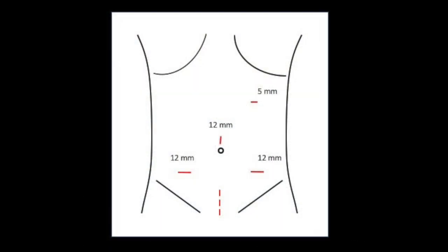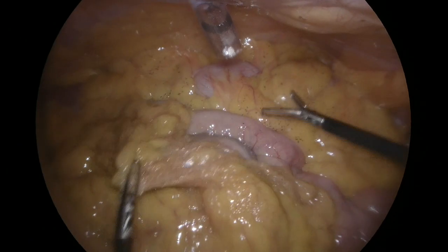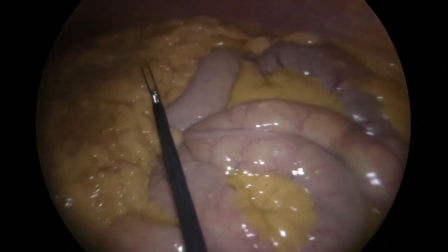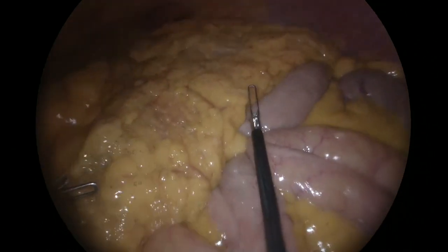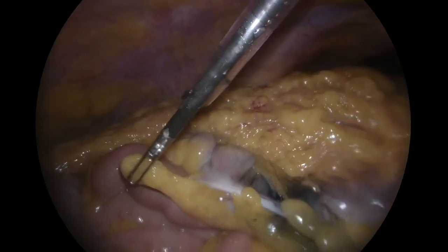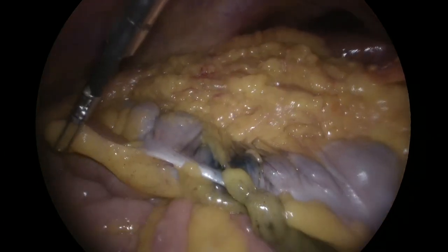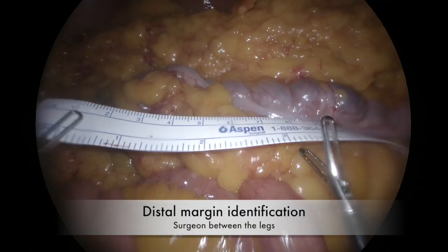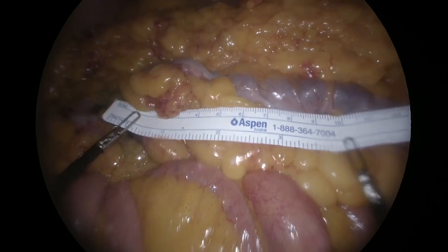Four ports were used and an old prostatectomy scar was used for specimen extraction. An extra upper right trocar can be optional. The abdominal exploration showed no ascites nor carcinosis. The preoperative tattoo was identified at the level of the proximal transverse colon, and a 10 cm distal margin was identified with a hemlock clip.